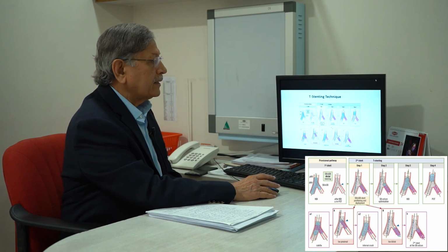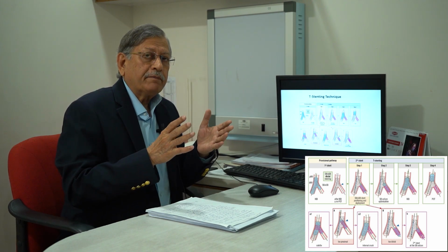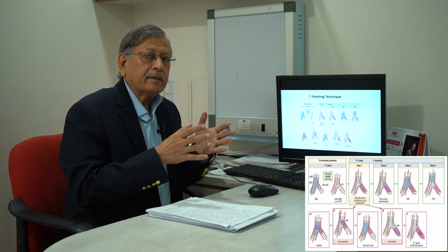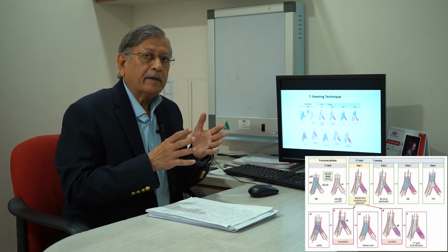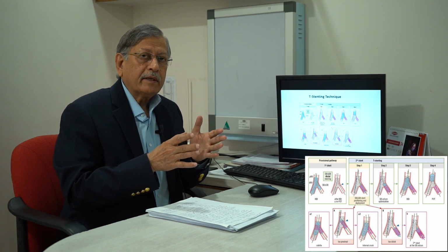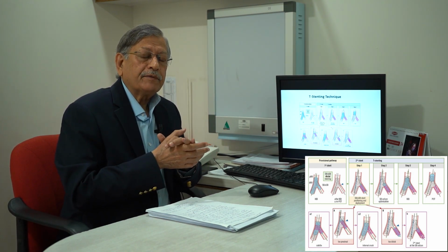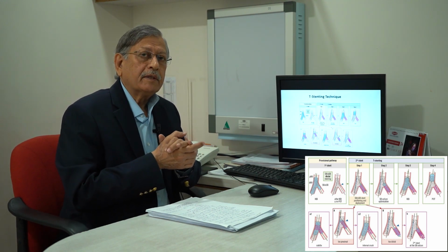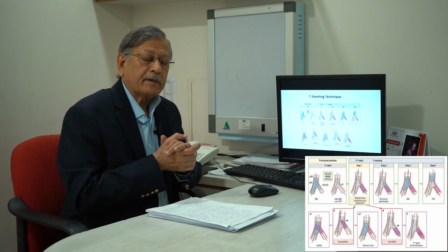Here is T-stenting. Now in provisional stenting, once you have deployed the stent, if you feel that the side branch is okay and doesn't need any further workup, then you leave it there and your job is finished. But if you think the side branch is pinched or there is significant plaque shift, then you need to recross through the distal strut.